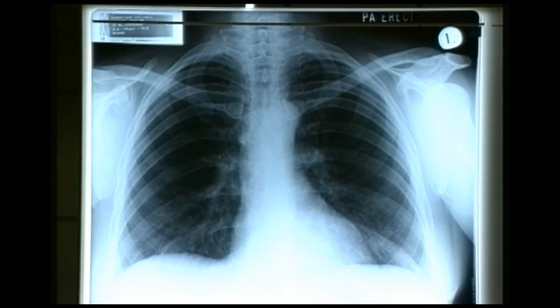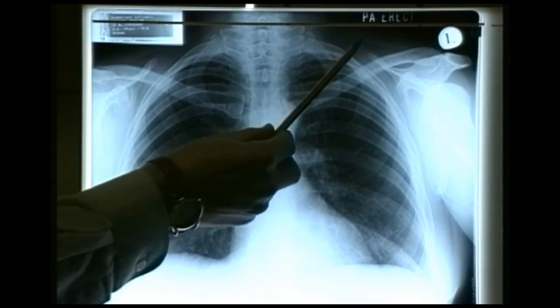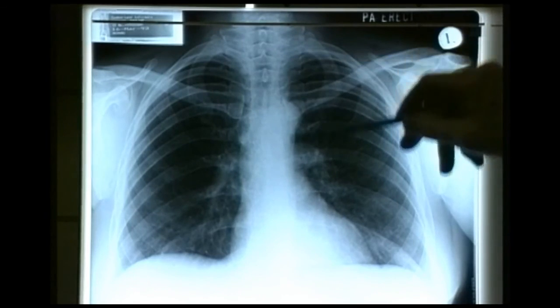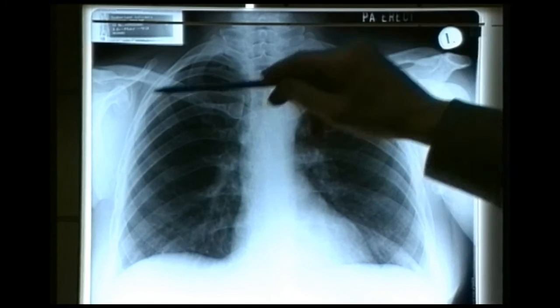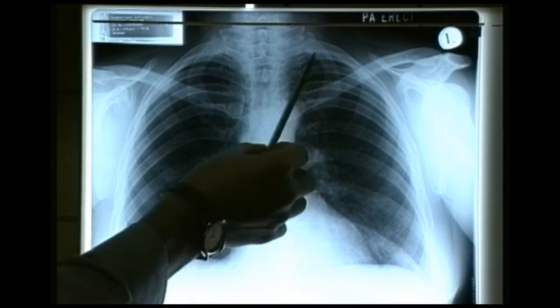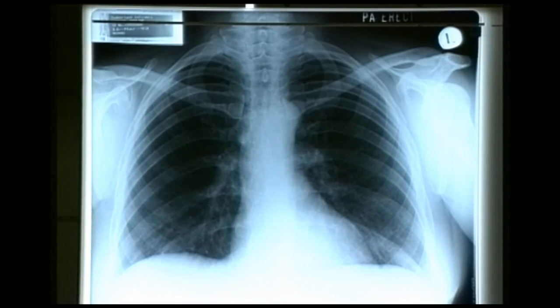We're now on the second of the series of trauma x-rays — the chest radiograph. This one is a PA erect radiograph whereas the initial trauma one is a supine view. The main reason we do this is to look for a pneumothorax or a large haemothorax — we may have missed it clinically and this is an extra check. In this case the lung markings extend right to the outer border of the chest with no dark shadowing representing a pneumothorax — this is a normal chest radiograph.